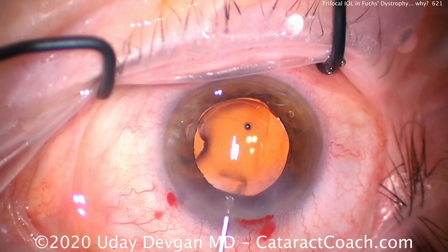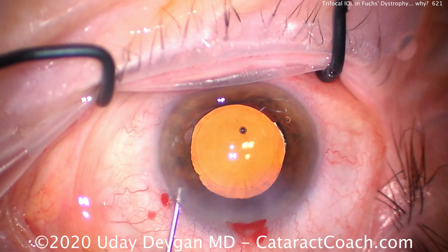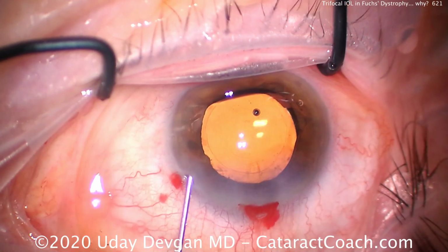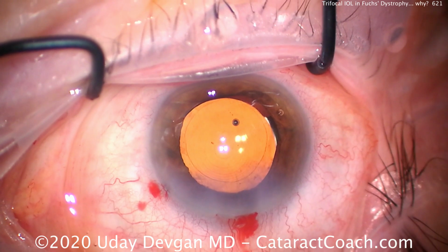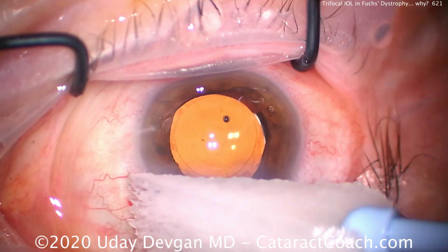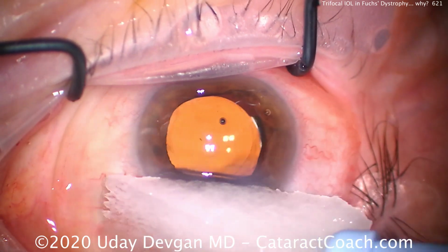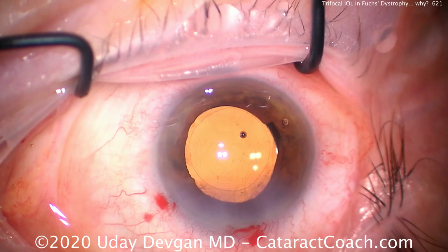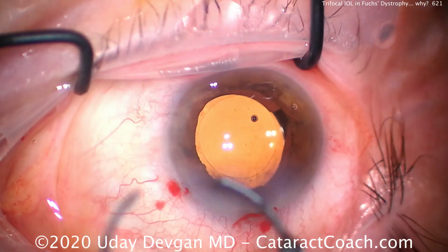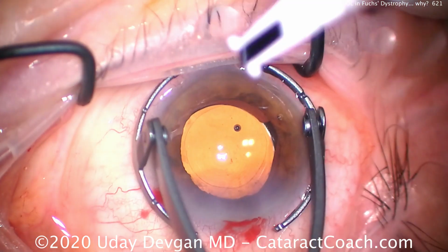Now, will the Fuchs dystrophy decrease the cell counts with time? Will the pachymetry get a little bit worse? Certainly all those things are possible. But even if this patient lives 10 years, I think the patient still won't need an endothelial cell transplant. And the reality is, with the pancreatic cancer, this patient may live only a year, maybe even less. And she wants to have the remainder of her life great vision and no need for glasses. And in this case, that's a very reasonable option.